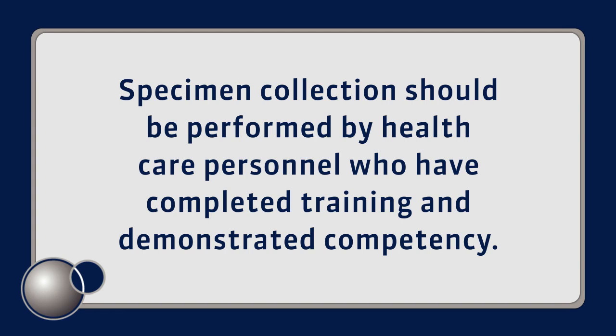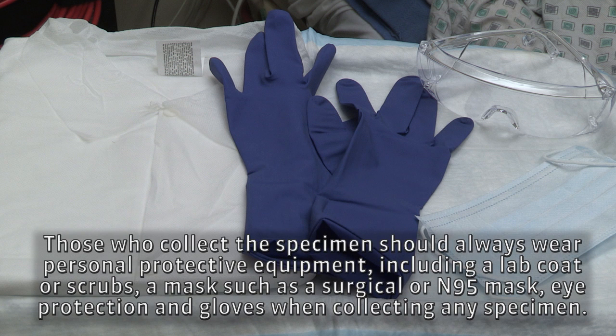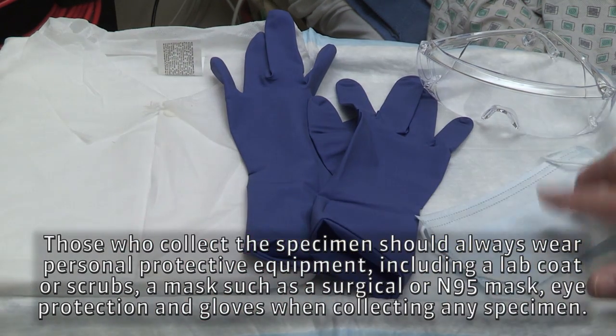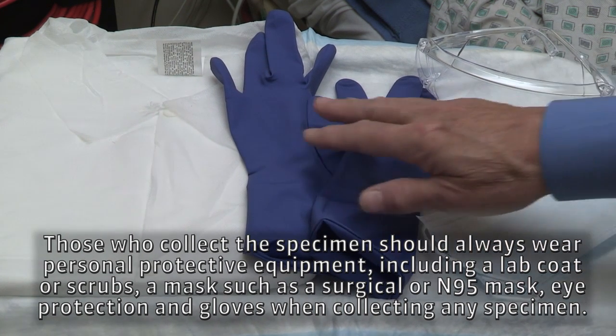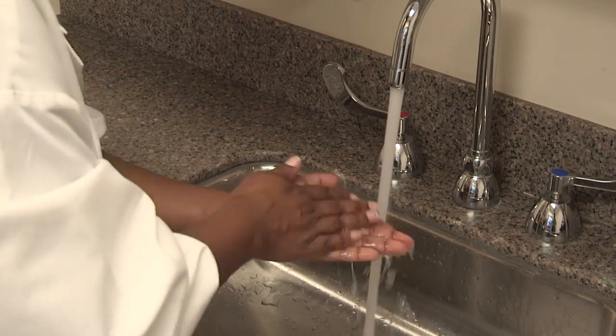Specimen collection should be performed by healthcare personnel who have completed training and demonstrated competency. Always read the manufacturer's package insert for specific instruction regarding specimen collection and transport for the type of test kit being used. Those who collect the specimen should always wear personal protective equipment, including a lab coat or scrubs, a mask such as a surgical or N95 mask, eye protection, and gloves when collecting any specimen. Always remember to perform hand hygiene before and after the procedure.